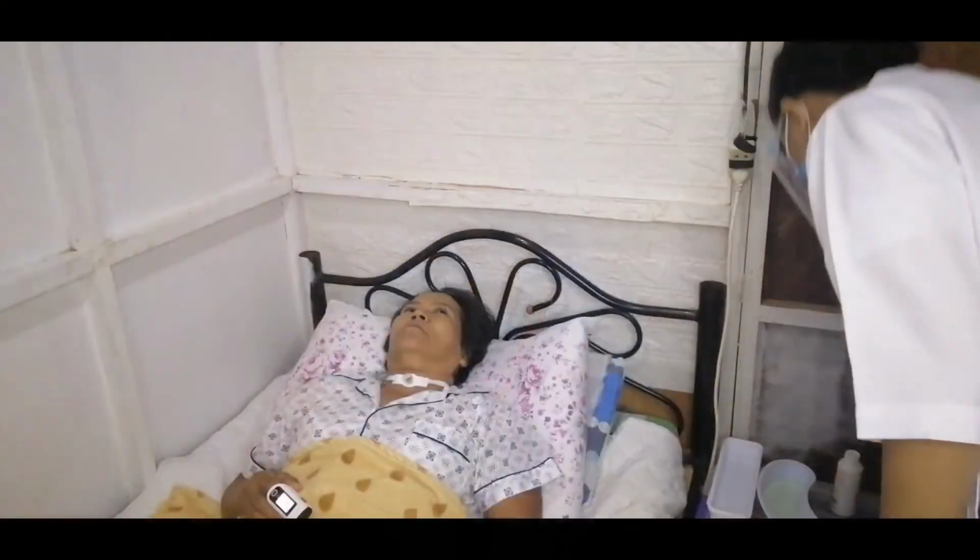Slide commercially prepared tracheostomy dressing or pre-folded non-cotton filled 4x4 inch under the faceplate.